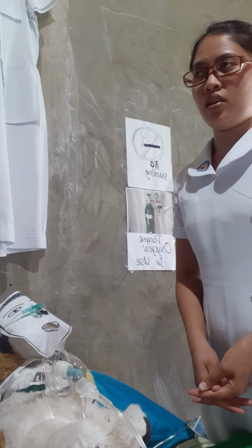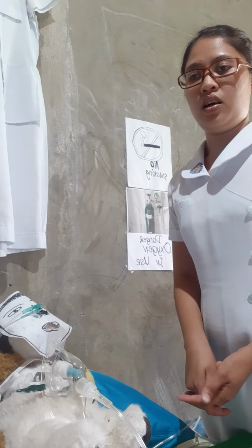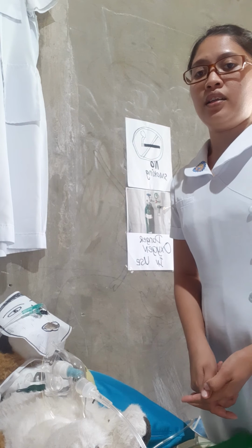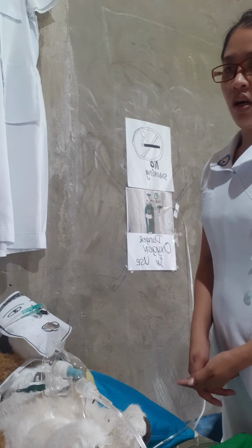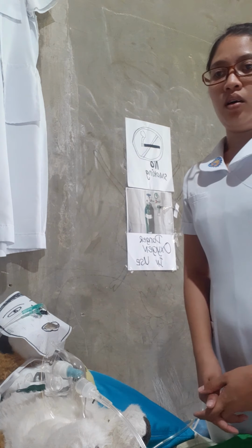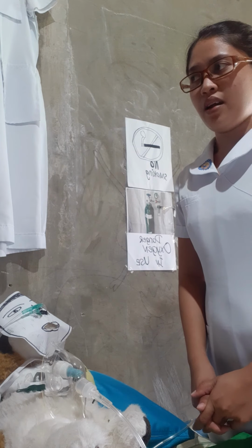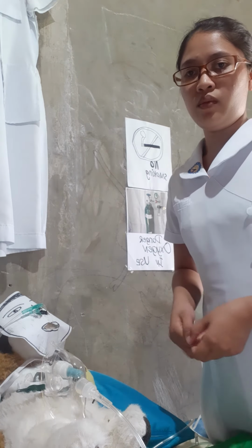Then next, for cleaning the inner cannula, disposable inner cannula of the tracheostomy. First, we need to prepare the supplies, and we need to open the tracheostomy care kit separately with the basins.